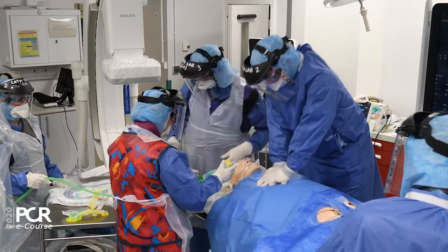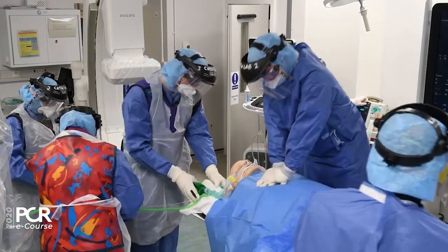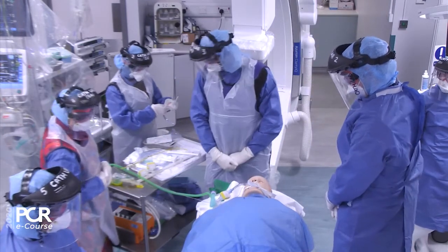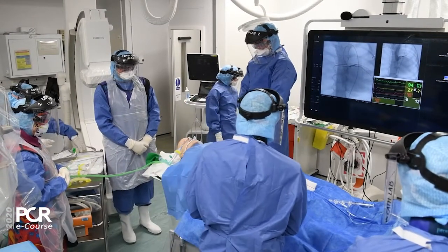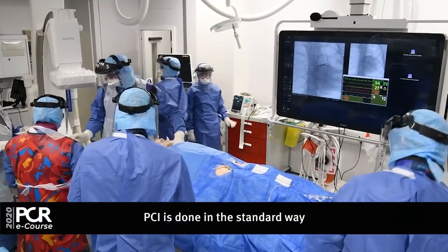Okay. You ready with another adrenaline? Yeah. Are you happy for us to shock him? Look at the rhythm. Okay. Shock. This should work. You get oxygen now. The oxygen saturation should be coming up. Clear. You've got some output. Fantastic. No more CPR. Get the camera back in.